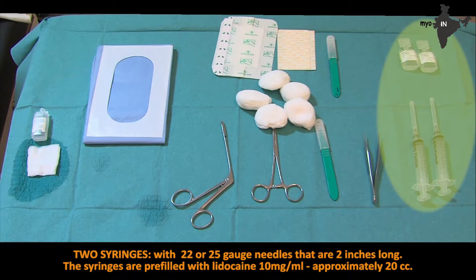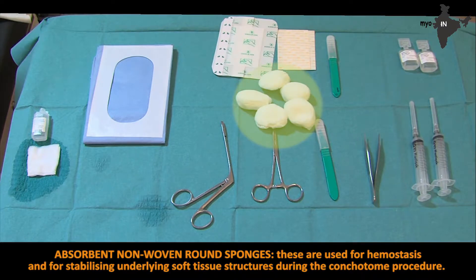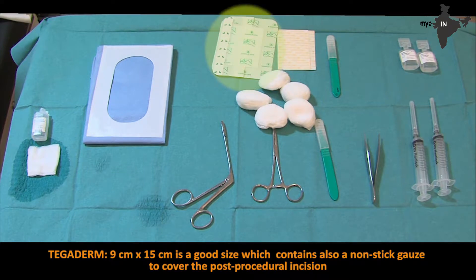Two syringes with 22 or 25 gauge needles that are 2 inches long, pre-filled with lidocaine 10 mg per mL, approximately 20 cc's. Absorbent non-woven round sponges, used for hemostasis and for stabilizing underlying soft tissue structures during the conchotome procedure. Steri-strips for opposing wound edges, half an inch by four inches or 12 mm by 100 mm, are a good size. Tegaderm, 9 cm by 15 cm, is a good size and contains a non-stick gauze to cover the post-procedural incision.